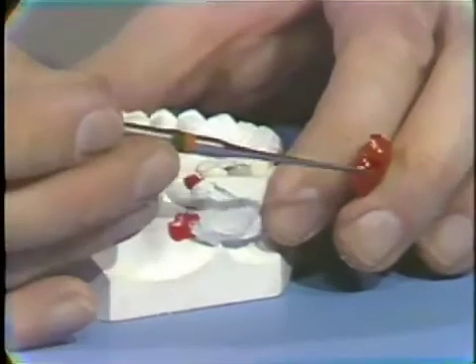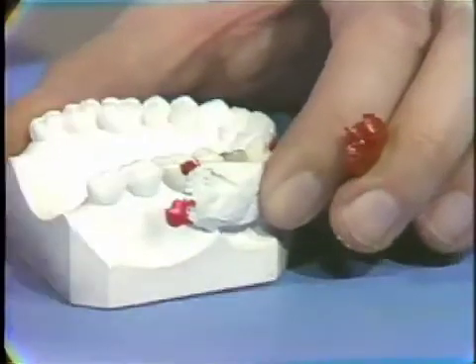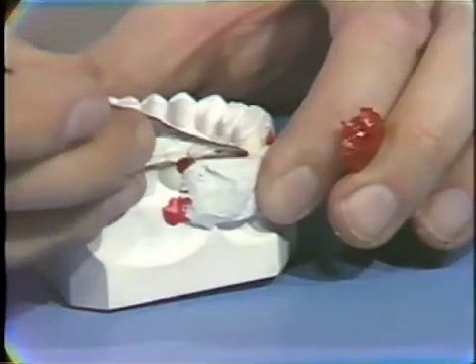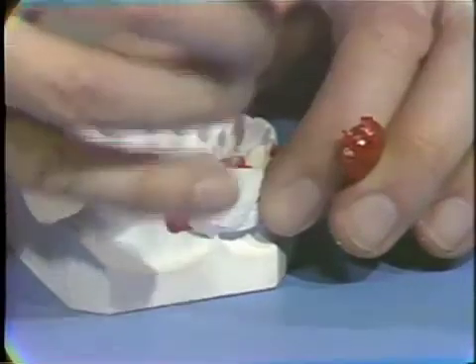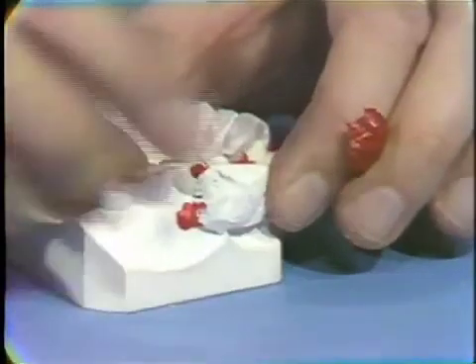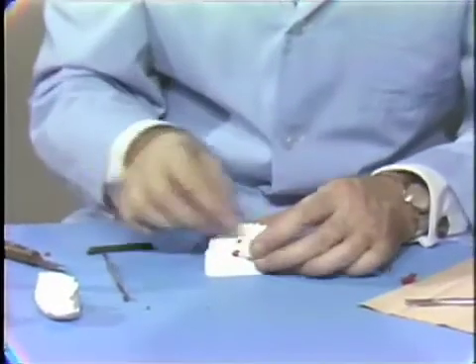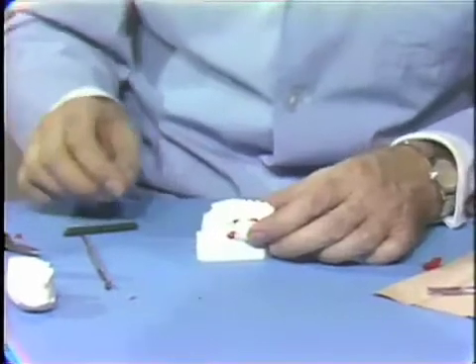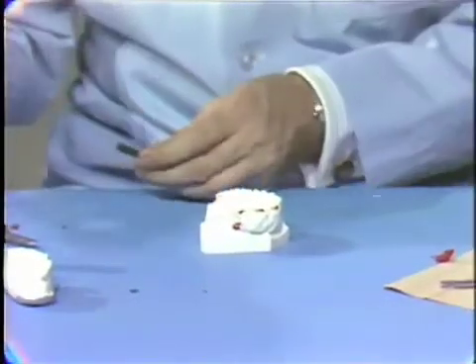Similarly, the tooth itself, or the facing, can be just tagged in here with a little wax. And then the wax on the lingual can be removed. So this will hold the tooth and the backing in position whilst the wax up is done.